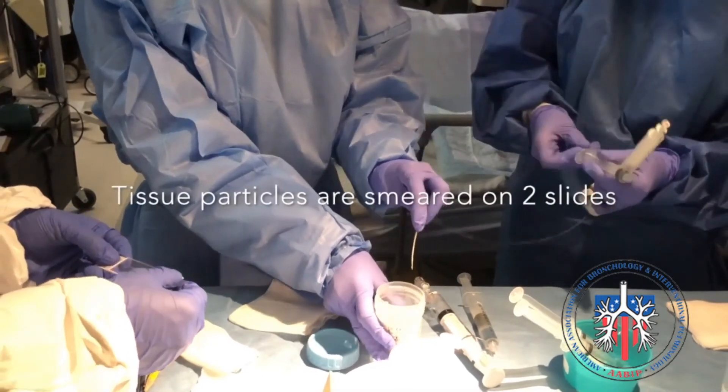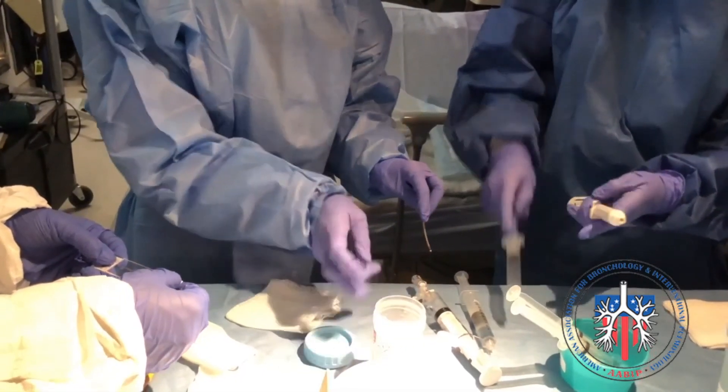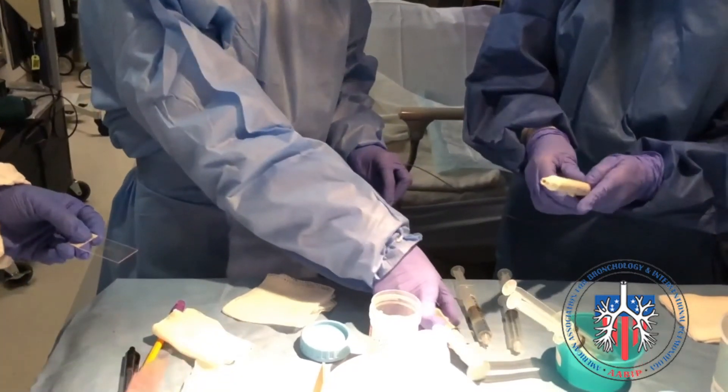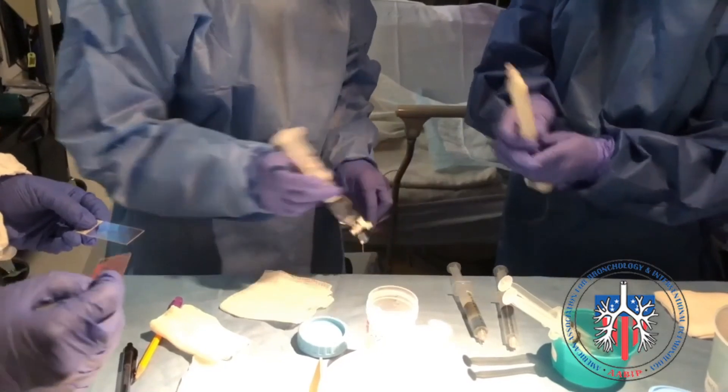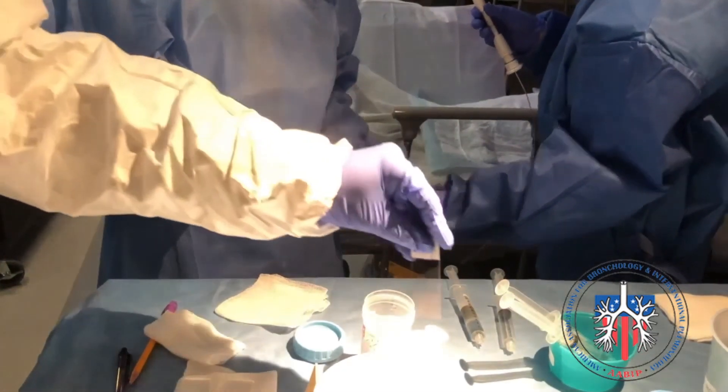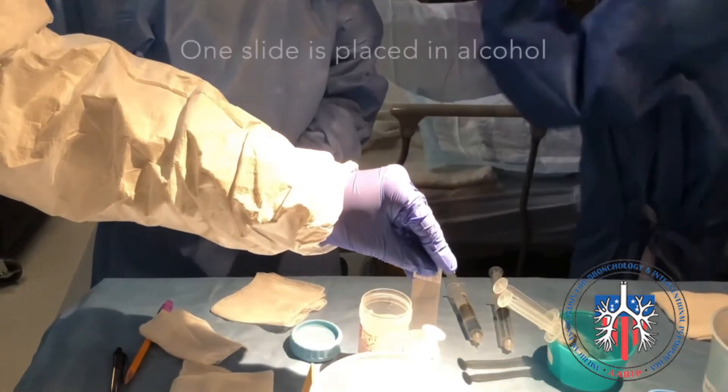The next part involves the cytotechnologist smearing the tissue material on two slides. One of the slides is placed in alcohol, while the other is air-dried, to be examined under the microscope.